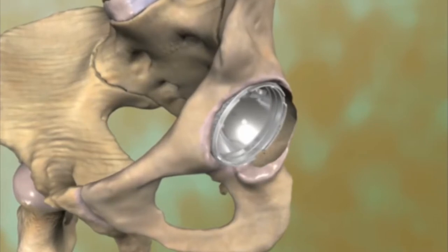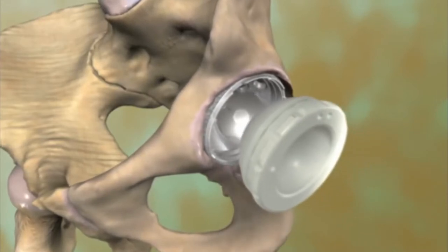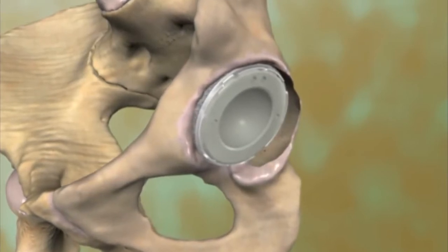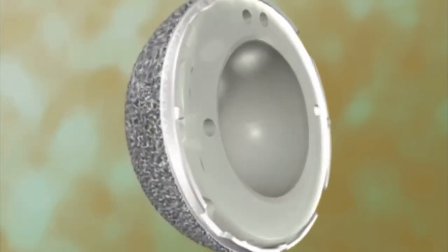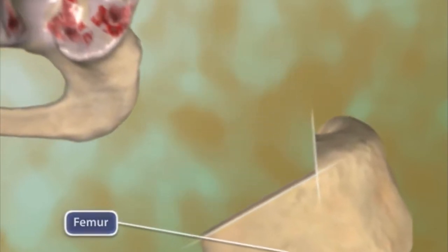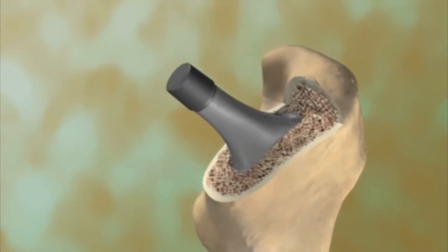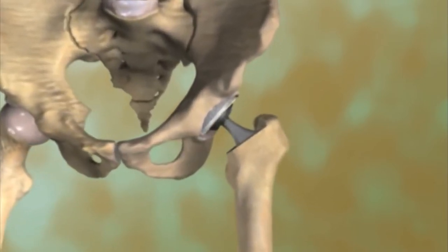The outer metal part of this component, sometimes called a cup, fits directly into the socket. The inner plastic portion has a hollow to hold the replacement for the ball-shaped bone at the top of the thigh bone, or femur. The outer metal part is rough to help bone grow into its surface over time to lock the artificial socket in place. The next step is removing the ball-shaped head of the femur, or thigh bone, and preparing the femur for placement of the stem portion of the component. A metal ball is attached to the end of the stem and fits into the artificial socket in the hip bone.